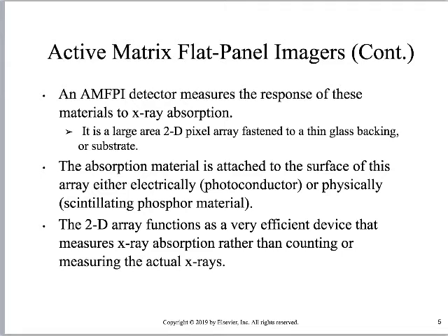So the TFT, why do you care? The TFT, it's blind to X-rays. It needs the absorption material to tell it something's going on out here, and then it can pick that up and turn it into an electrical signal.